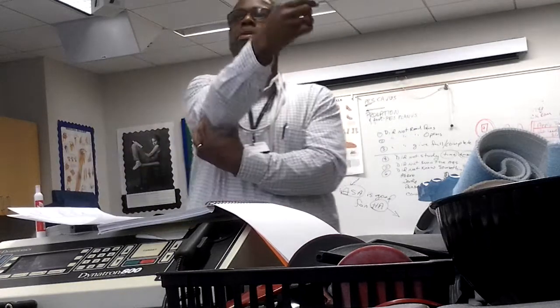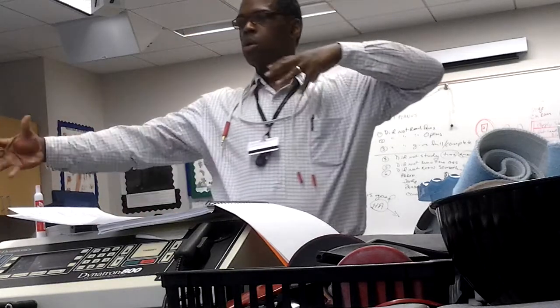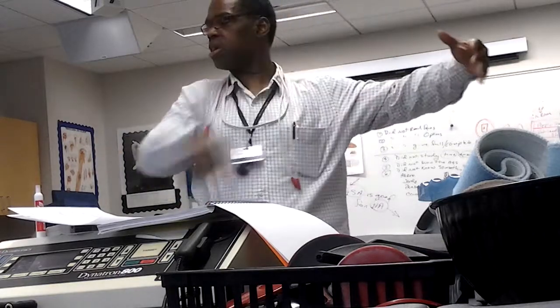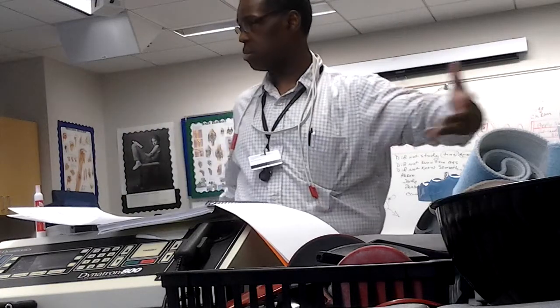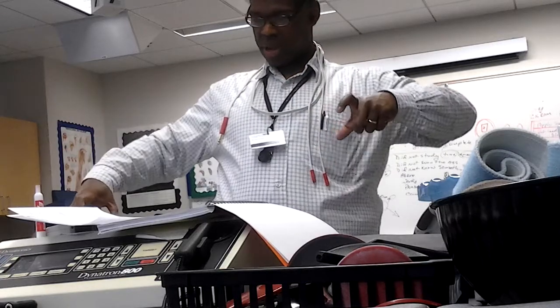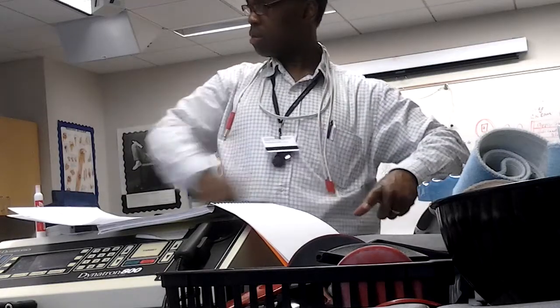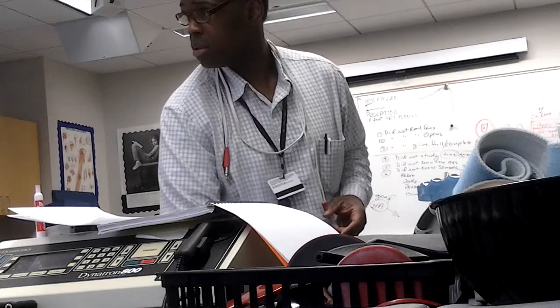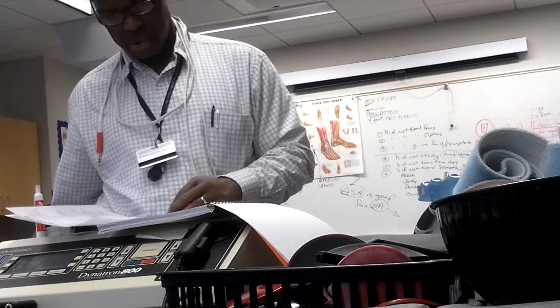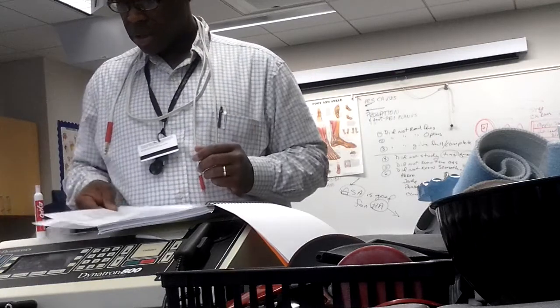Sometimes I may not be able to put it right over top of an area because of bones. I have to move it somewhere else and around, so I may go way above and way below, and because the energy can go between the 2 pads, I can still treat the area. Okay? So, if I'm treating, let's say, a low back, I can put it, let's say, lateral hip and medial hip, and it'll get right there in the center deep. Okay, because it's not over it. It's not over it, or even right there around it, but it's far away from it.